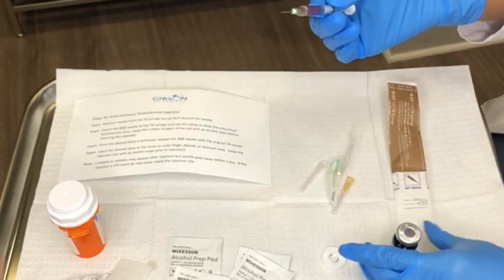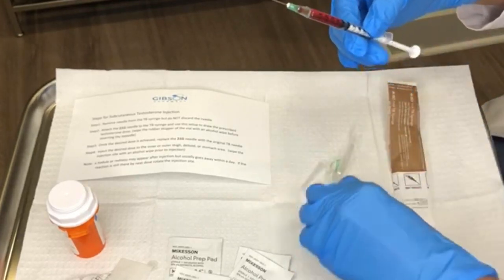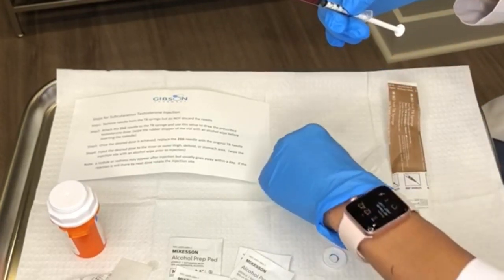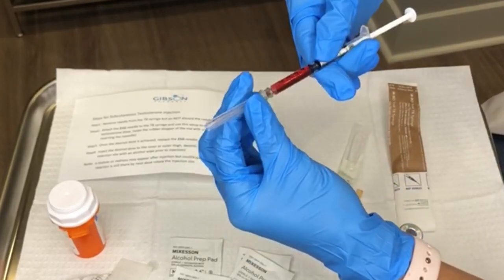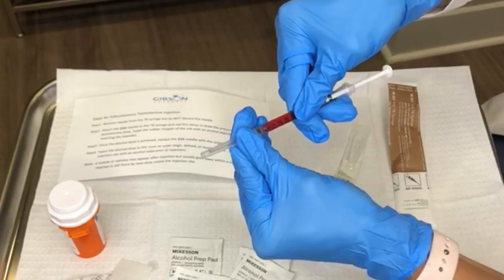Now that you've completed that process you're going to need to swap out the needles again so that you can get ready to inject. Go ahead and recap, unscrew, and then screw on the 26 gauge needle.